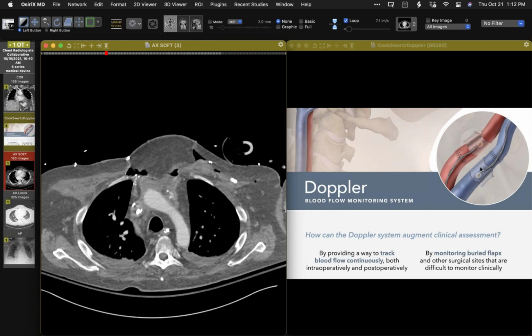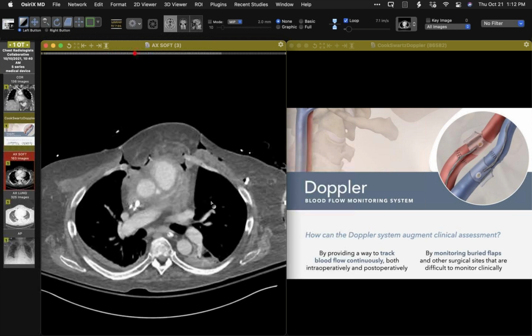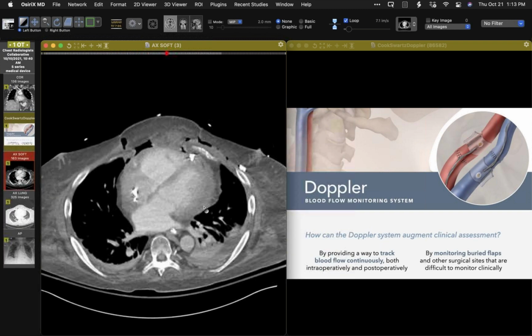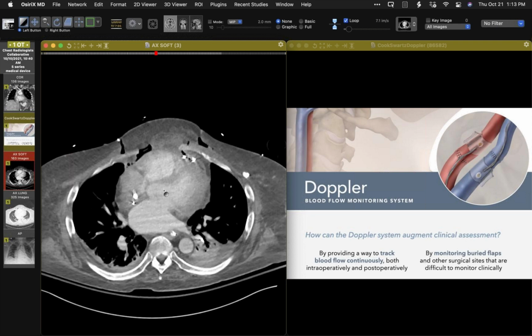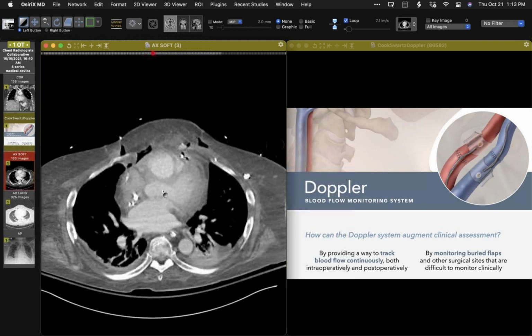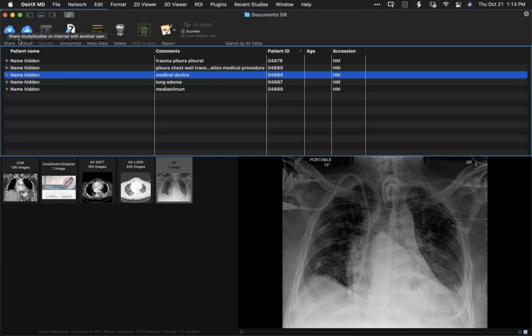And you can see how it connects to a very small artery or vein in order to monitor the perfusion of the vascularized flap that they have used for the procedure. So just to clarify what that item is, I've seen that before in the context of neck surgery, head and neck surgery for tumors, but the first time I've seen it used in this particular occasion. So it just clarifies what that is.